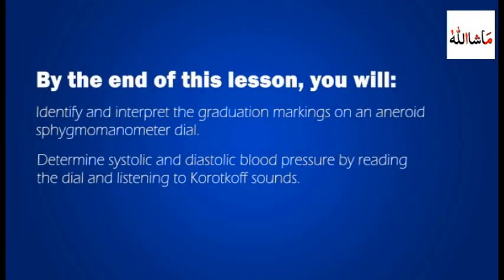By the end of this lesson, you will identify and interpret the graduation markings on an aneroid sphygmomanometer dial, and determine the systolic and diastolic blood pressure by reading the dial and listening to the Korotkoff sounds.